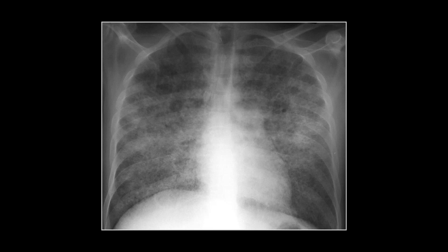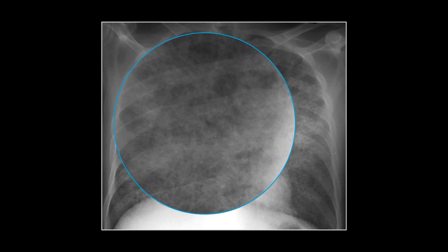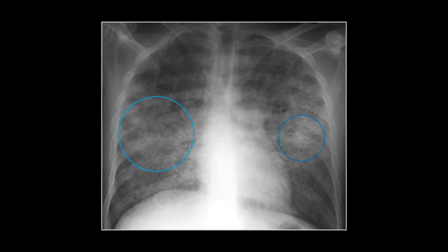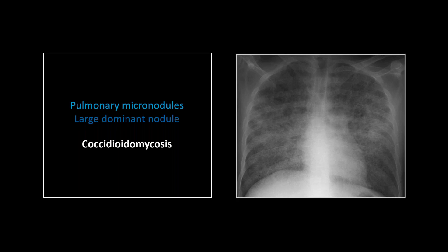Our next case also has such extensive involvement that in the center you've just got white, so look to the edge to determine the pattern. There's also a dominant nodule here, which is diagnostically helpful. Looking to the edges, you can appreciate this is actually micronodularity — miliary spread. Tumors like thyroid and melanoma can have a similar appearance, but you're typically thinking TB and cocci. That's especially the case when there's a giant dominant nodule suggesting an original focus of infection. To distinguish TB from cocci, look for mediastinal calcifications: with TB you'll probably have them; with cocci you almost certainly won't. This is a case of coccidioidomycosis with miliary spread.